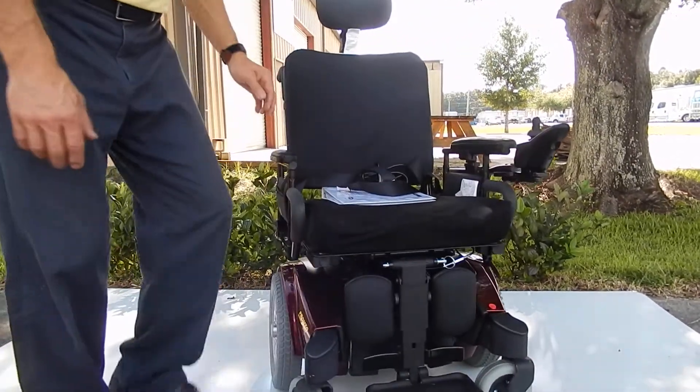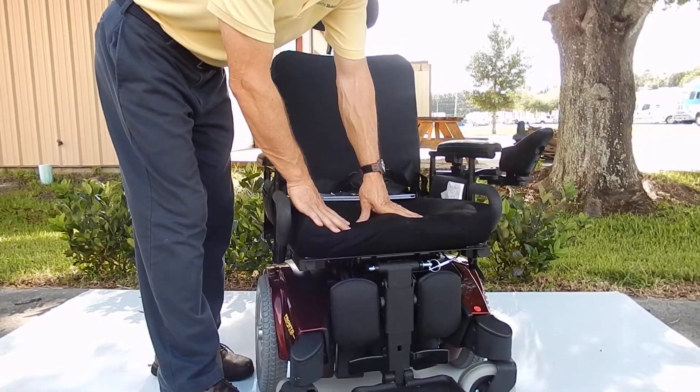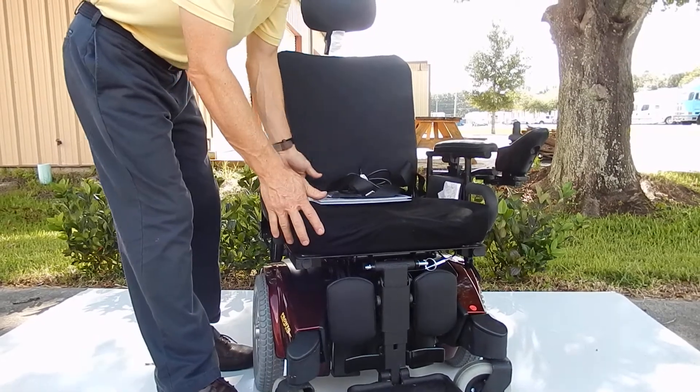The seat on this chair is 20 inches wide, and you can put your own cushion on here — any cushion that you want to put. You can put gel, Roho. This is just a regular foam cushion, but any cushion you want to put on there, you can. You've got a 20-inch cushion by about 19 deep.